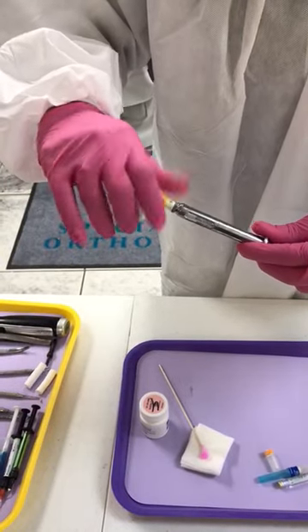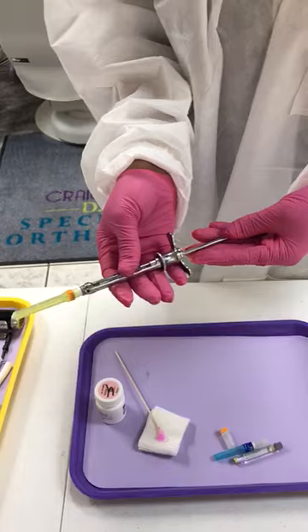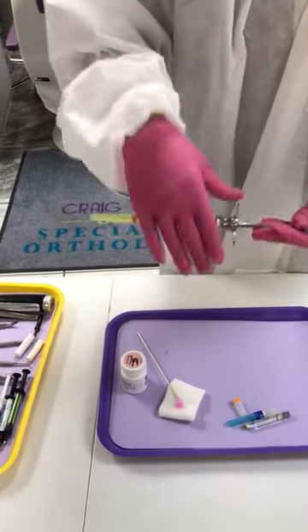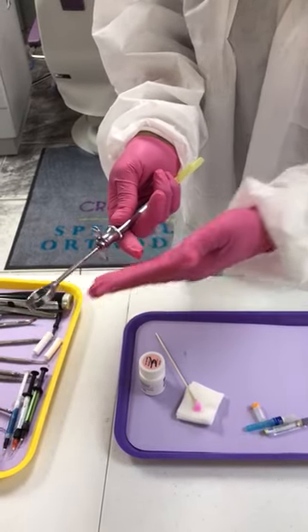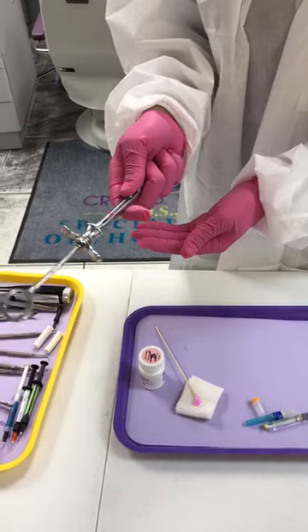When you hand it to the doctor, you always hand it away from the doctor — like this — so that this part is going towards the doctor and this part is towards you. The doctor pulls it back, and you retract it a little bit and remove the needle cap.